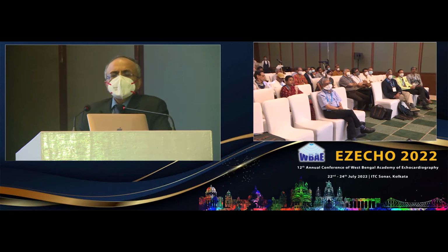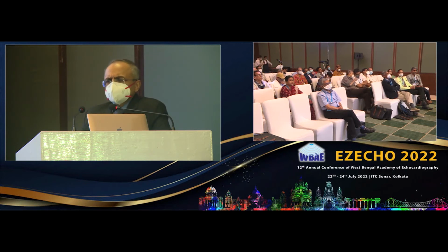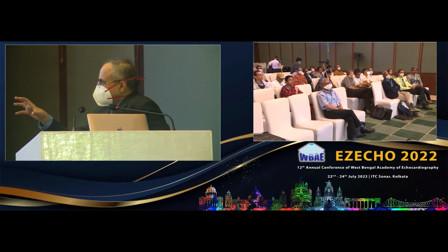Though the guidelines will take a long time to take it into their fold, ECV expansion and LGE can be another further refinement for sending the patients for valve replacement. Even for the regurgitant lesions, it has been shown by studies for AR and MR, by big groups like Dr. Dipen Shah's group, that the ECV was very important, and it was additive to the regurgitation fraction and volume.